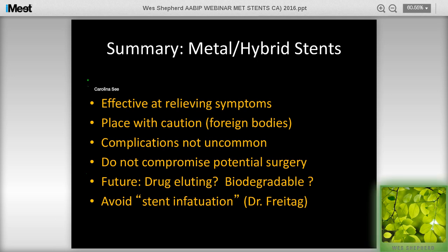So any initial questions for Dr. Shepard? That was an excellent talk. Do you find any differences in as far as ease of removal between the Ultraflex and the Aero stent?